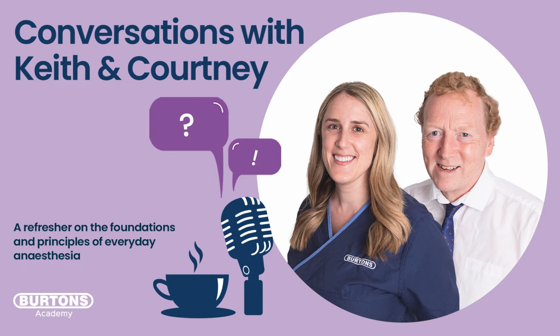There's probably something else happening to the patient. Yeah, maybe the depth of anesthesia is a bit deep. Therefore, they're dulled to the response of taking more breaths to get rid of that excess CO2. And because our patient's too deep, not only are they hypoventilating, maybe their blood pressure is low as well.